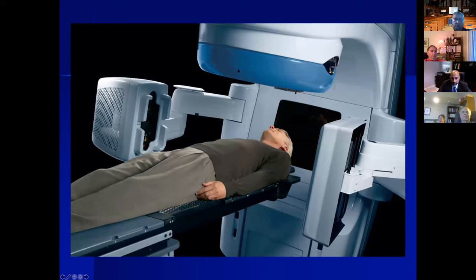This is probably a little bit better picture. These arms here, this is the one that generates the KV images that allows people to do cone beam and to lock onto fiducial markers. The head of the machine is the business end, where the radiation comes out. There's also an arm here that can come out and take additional images to verify positioning and things like that. But essentially, this is what modern linear accelerators have. We're also a little bit lucky at some of our centers, we have some of the newer technology. We have a robotic couch now that can also control for motion of the gland, which rotates patients and adjusts for pitch and yaw, which is another nice feature of some of the newer technology.